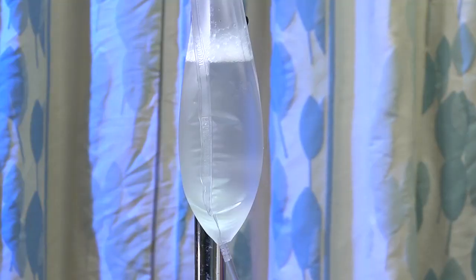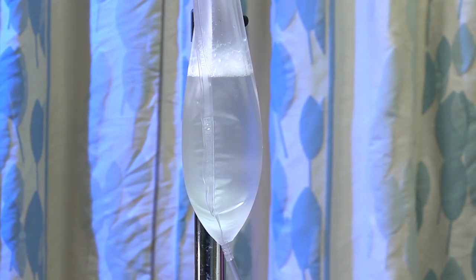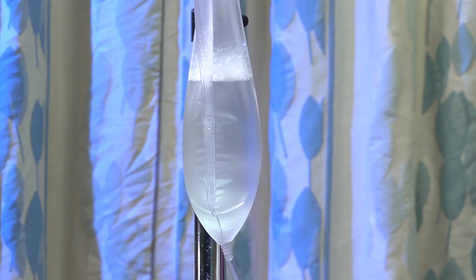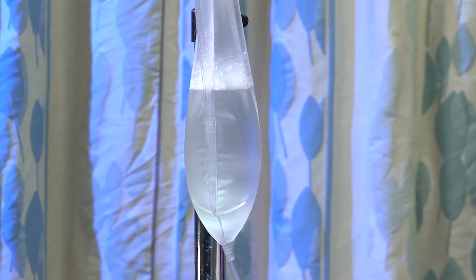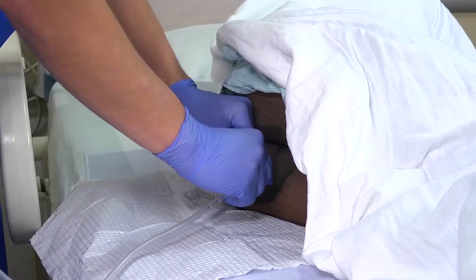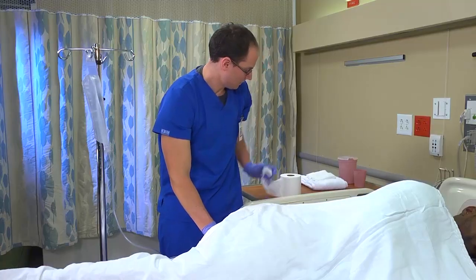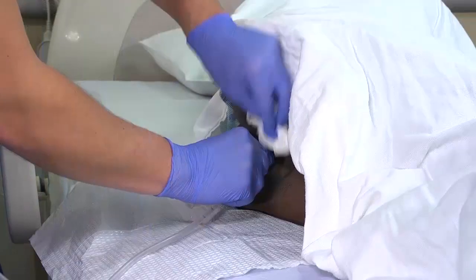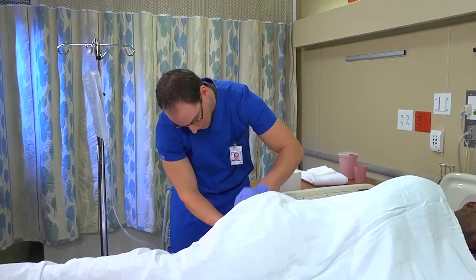Once the flow of the fluid has been established, you may hang the enema bag from an IV pole. If the patient has cramping or if fluid escapes around the rectal tube, lower the container or close the clamp. When all the solution has been instilled, clamp the tube. Tell your patient that you've completed the procedure. Place toilet tissue around the tube at the anus and gently withdraw the rectal tube and tip.